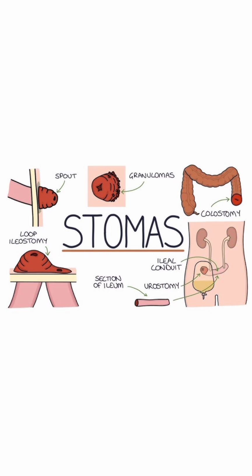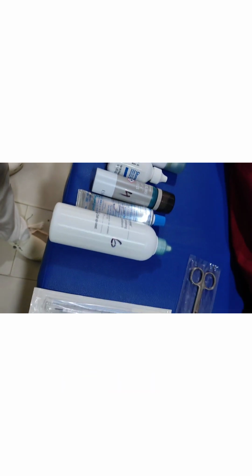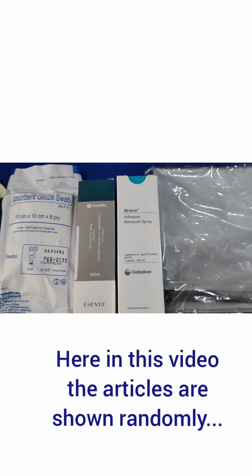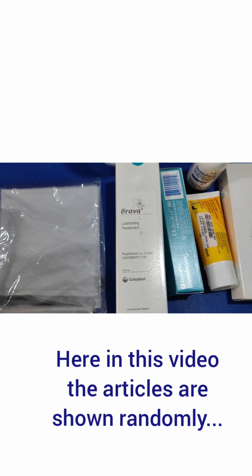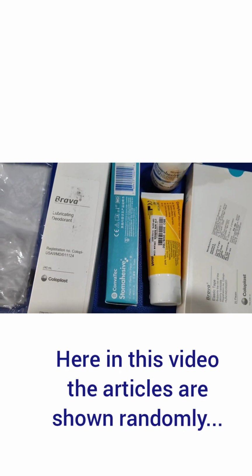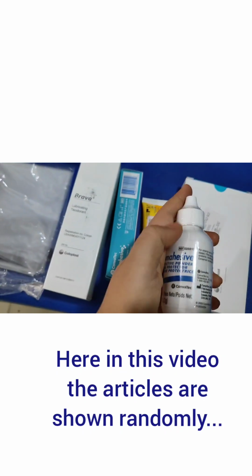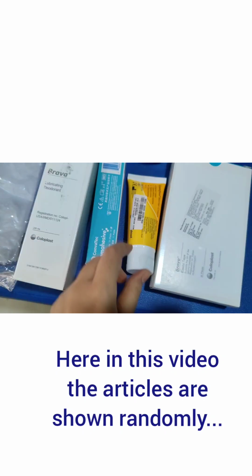If we talk about the different types of stoma, we'll be discussing in another video, so we'll not go into the types of stoma. Just let us know what are the articles required for stoma care. So a stoma care kit includes a stoma bag pouch, right? According to the correct type and size of the stoma, the bag is used. Then adhesive tapes are used. Then base plate or the stoma plate are used.